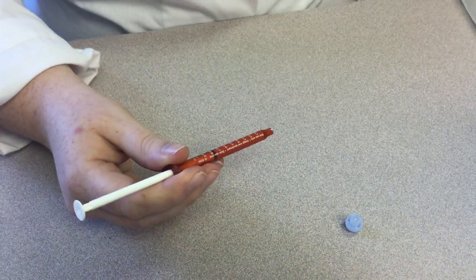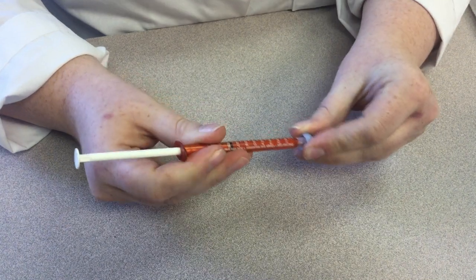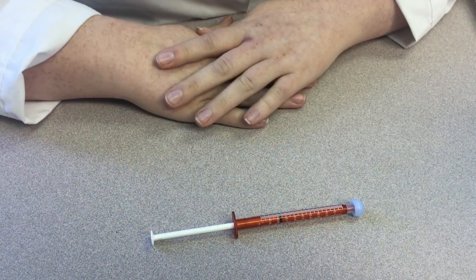You will then apply the cream, recap your syringe, and you will wash your hands again after applying the cream to the designated area.